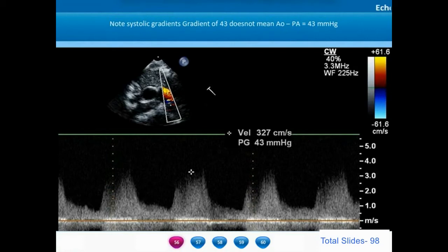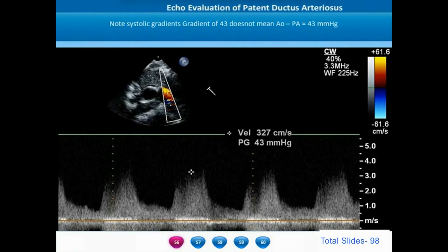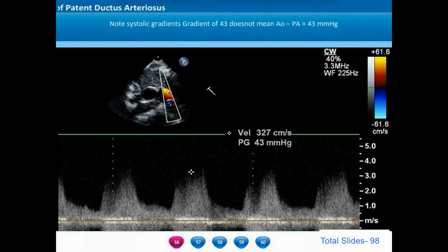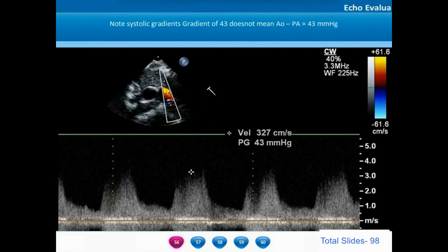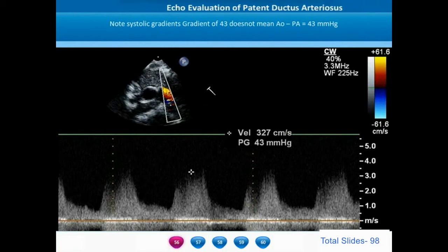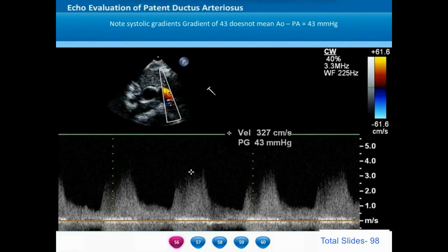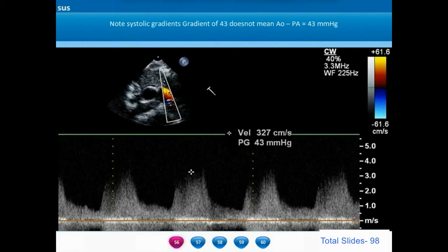The ductal peak systolic gradient will falsely be exaggerated due to the large flows and high velocity. What is useful is the end diastolic gradient. In end diastole, the gradient from the aorta to pulmonary artery is less than 1 m per second, meaning the diastolic pressures in the aorta and pulmonary artery are more or less similar. This clearly indicates that the pulmonary artery pressures are similar to aortic pressures and the patient has severe pulmonary arterial hypertension — hyperkinetic, flow-dependent, severe PAH.